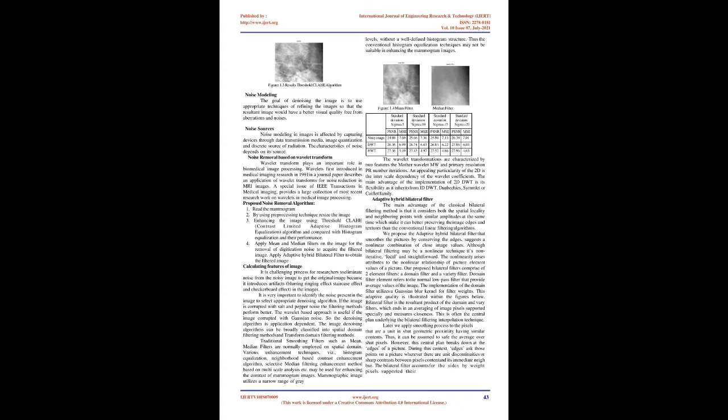The contrast, especially in homogeneous areas, can be limited to avoid amplifying any noise that might be present in the image. Threshold CLAHE method helps in increase of global contrast of an image compared with histogram equalization method. The CLAHE method, being an adaptive algorithm, works for multi-resolution images. Objective: threshold CLAHE technique is applied on original input mammogram to enhance the contrast.